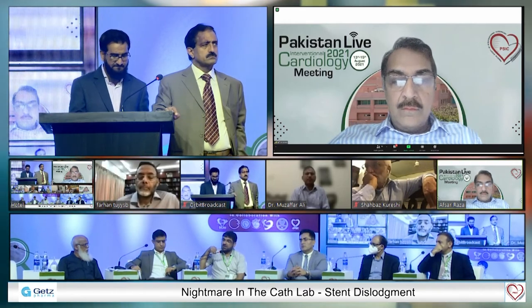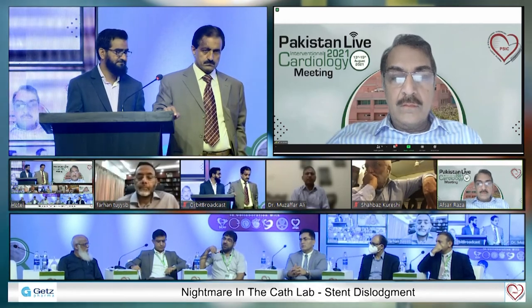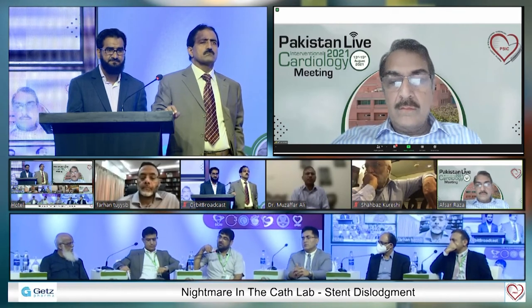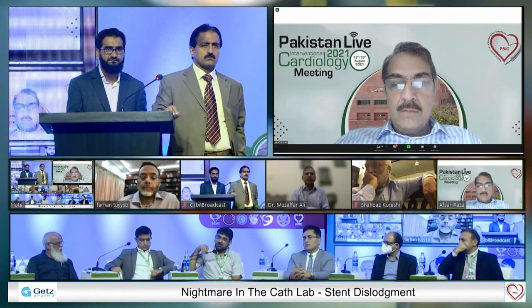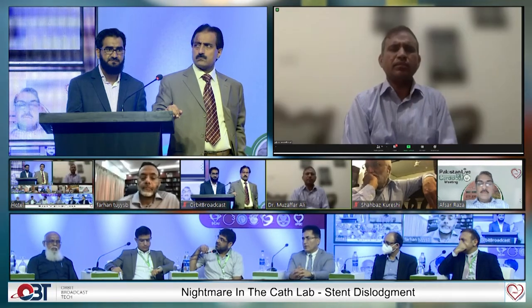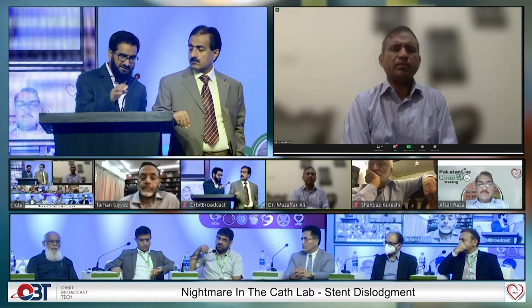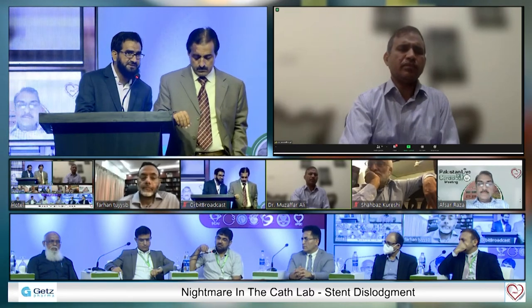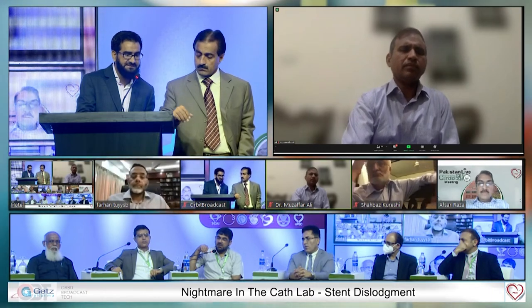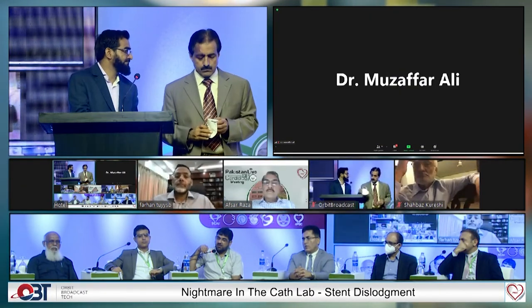You can switch the JR guide to an AL guide before proceeding, or you can take two wires for support. Which smaller balloon did you take for retrieval? I used a 1.5 by 15 millimeter balloon, which was the smallest balloon available in the cath lab. And what techniques did you use?